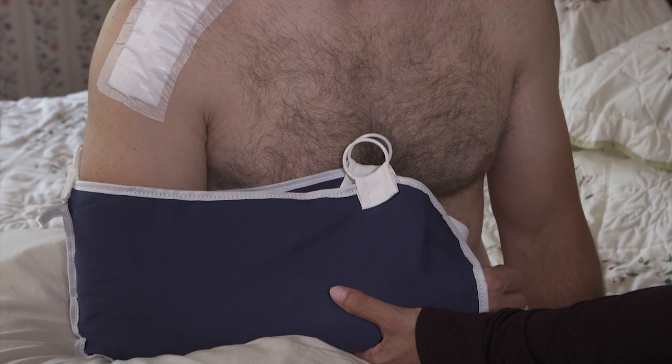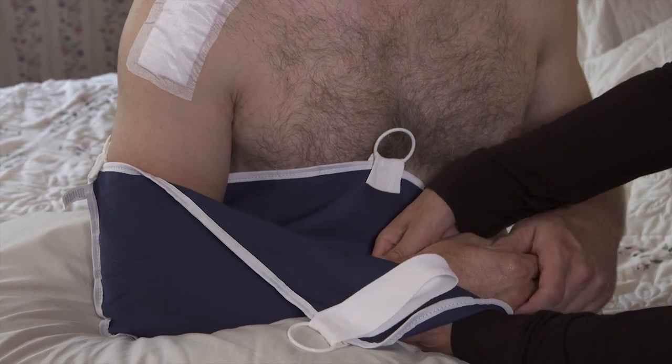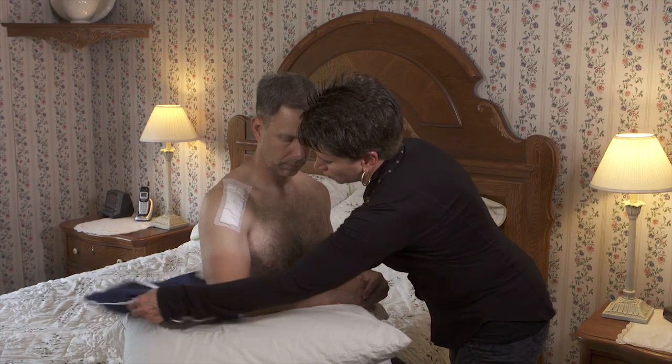This program demonstrates how to put the sling on and take it off with a caregiver's help. You may be given different instructions. Always follow the directions of your healthcare provider.